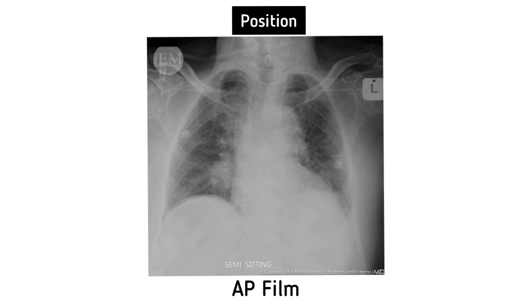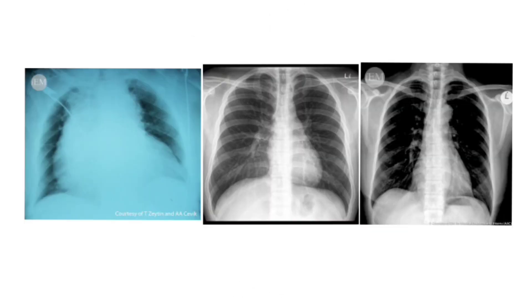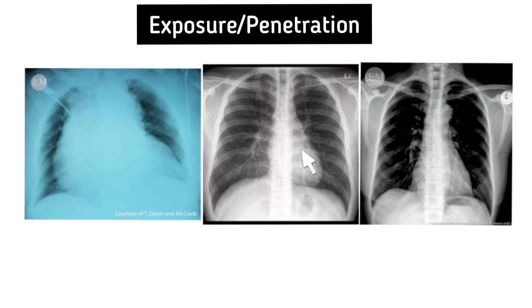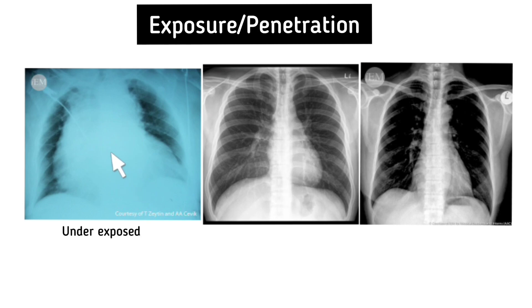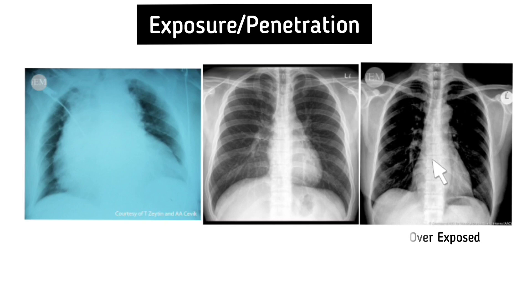Next, talking about exposure or penetration. Ideally, you should be able to see the heart, blood vessels, and intervertebral spaces. If the film is under-exposed, you will not be able to see them. If the film is over-exposed, you are able to see all vertebral bodies with obvious intervertebral spaces.